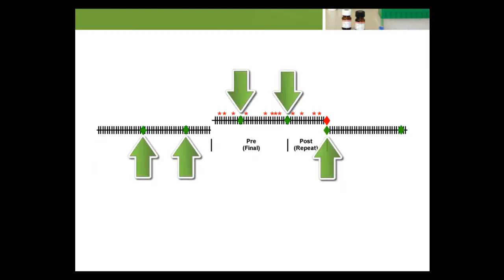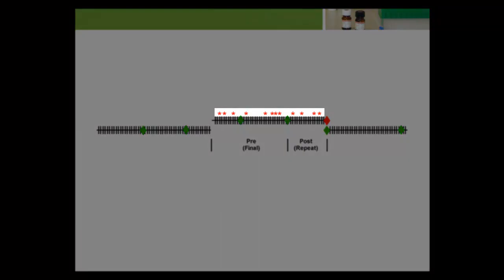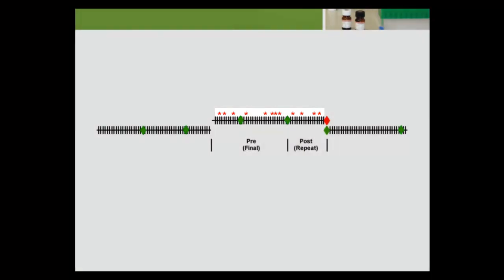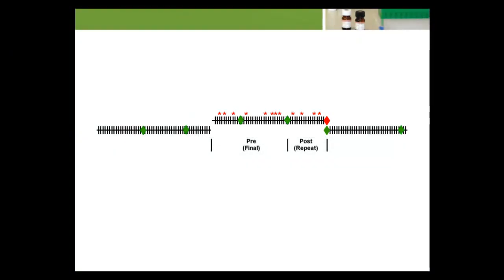The green diamonds represent acceptable QC events, and the red diamond is a QC rejection. The asterisk represents an unreliable patient result. The vertical shift in the analytical process represents a persistent error condition that's resolved after it was detected by the QC rejection. It takes 3 QC events to finally reject and identify the error.